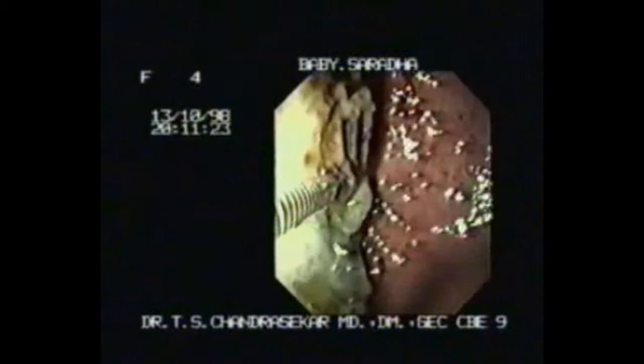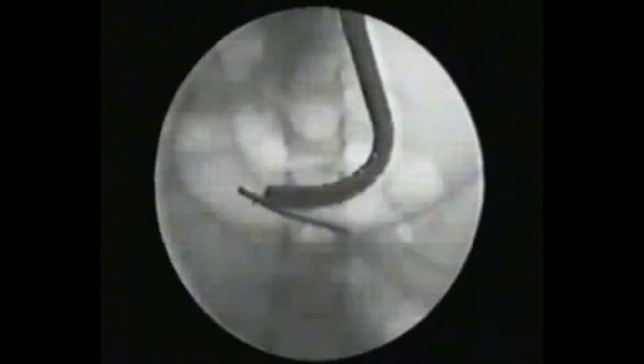Varieties of foreign body forceps are available like rat tooth type, basket, and polypectomy snare, which need to be used accordingly. Sometimes one may need to use the oversheet for removal of pointed and sharp foreign bodies. Thank you very much.